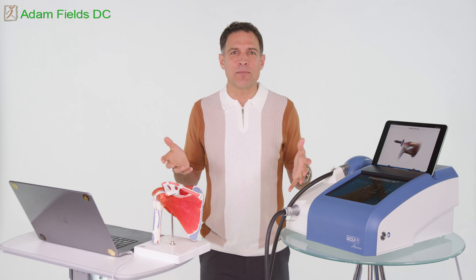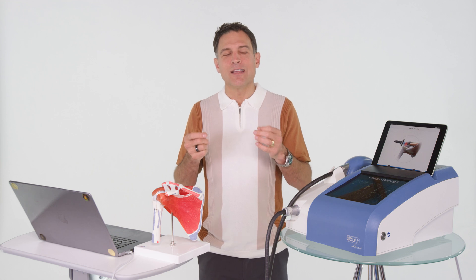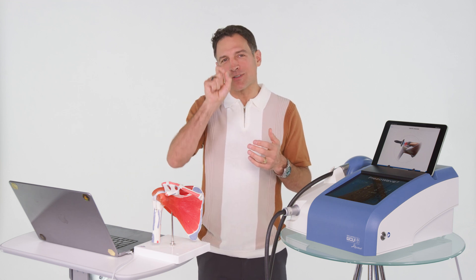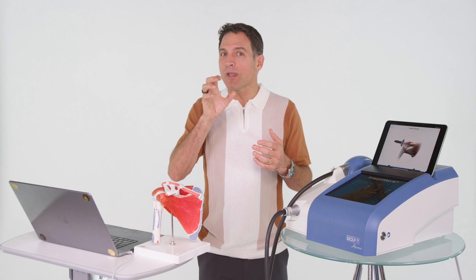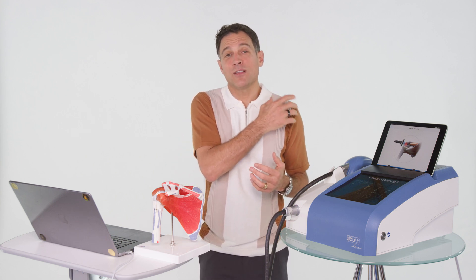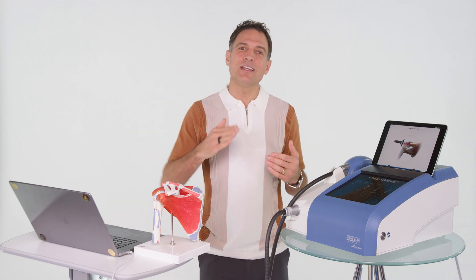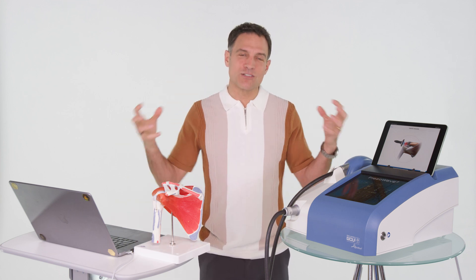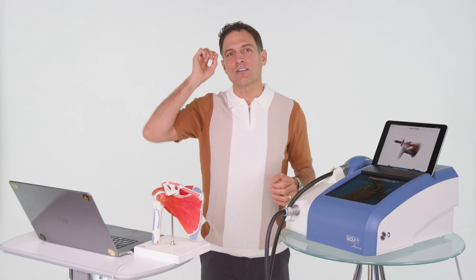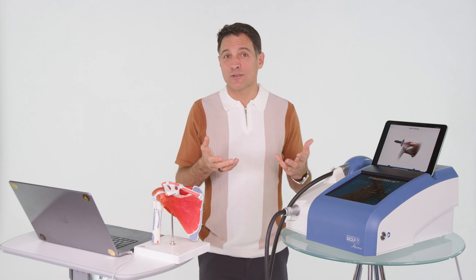You might be asking yourself, well, I haven't had an MRI — how do we know what's going on? What happens with this machine is it goes in at the prescribed depth, and we know where we are and what structure we're on, and you will feel it. Your body will give you feedback — you'll actually have pain when we're on the right spot, and that's where those adhesions are being broken up and blood is being brought into the area. It's almost diagnostic, and it creates biofeedback during the treatment.